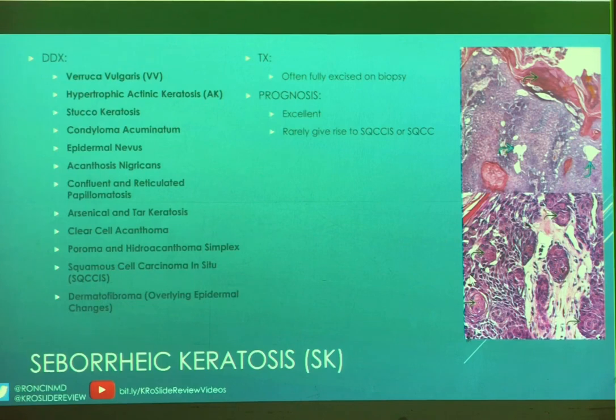For treatment, often they're fully excised on biopsy. As we saw in our case, we had nice regular epidermis on the edges, or you will see when you spend more time on it, and the prognosis is excellent. Very, very rarely these give rise to either a squamous cell carcinoma in situ or squamous cell carcinoma, which would be the invasive variant. And a few more pictures of seborrheic keratosis.